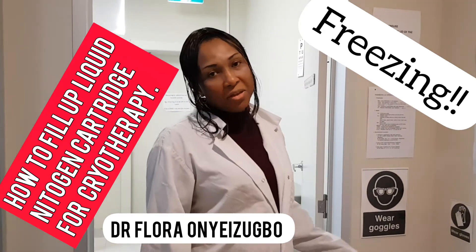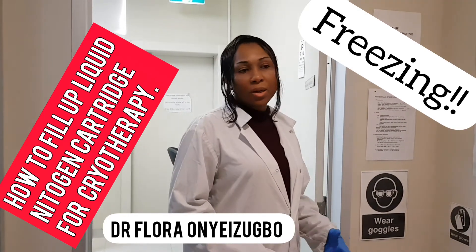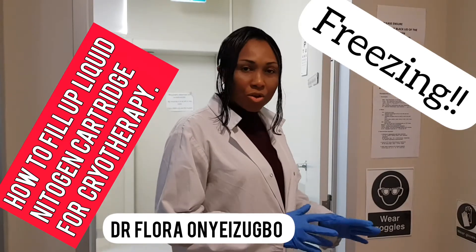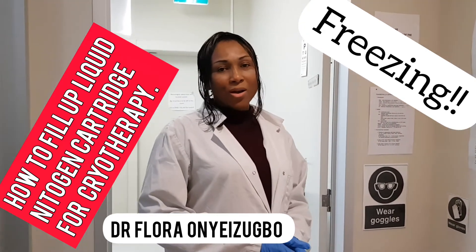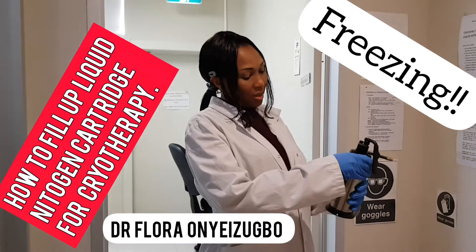Liquid nitrogen is used for different things, including freezing of warts, seborrheic keratosis, and other lesions. It's commonly used by doctors, but sometimes the technique can be a little bit tricky. So today I want to show how we fill up the liquid nitrogen in the cartridge.